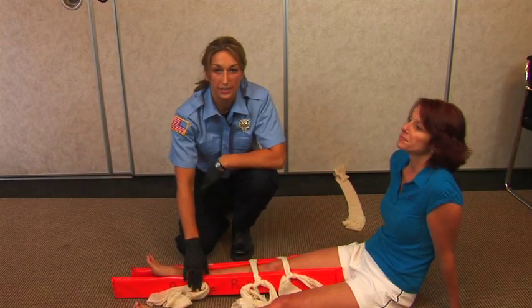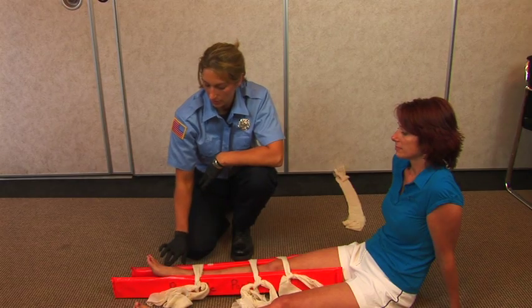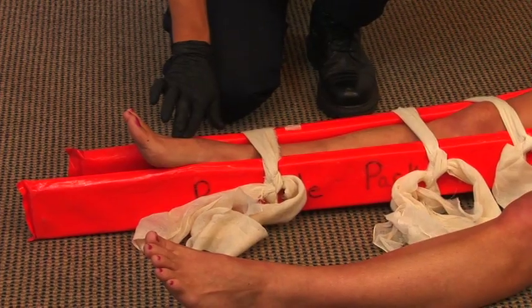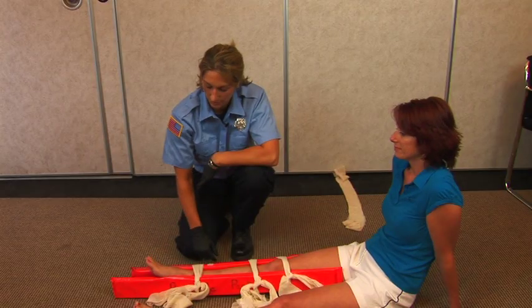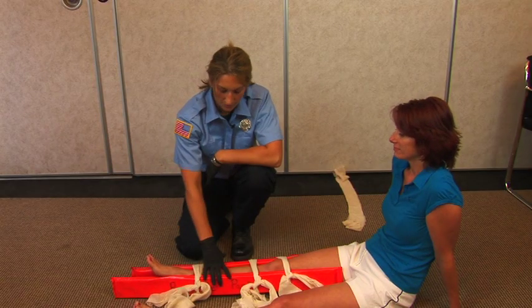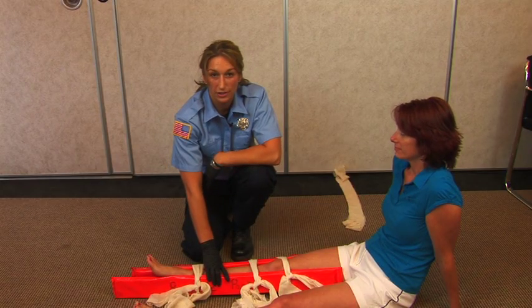Once you're done splinting, it's very important to make sure that you check for pulse, motor, and sensory again. Feel for a pulse. Can you feel me touching you? And can you move your toes? At this point you can place somebody onto a longboard and then place them on the stretcher.